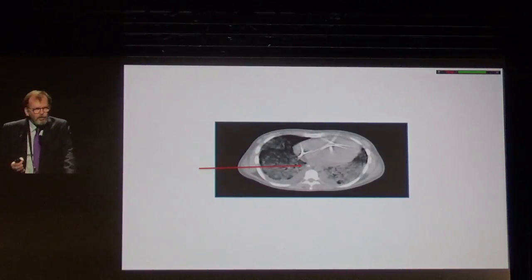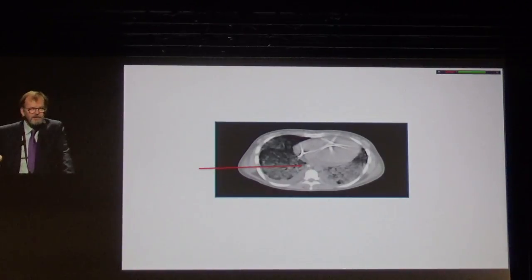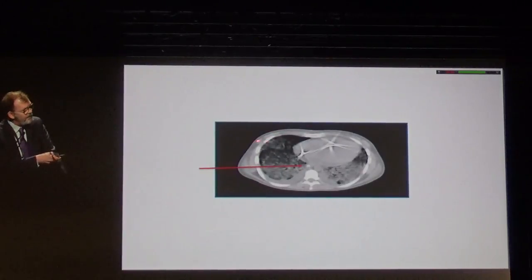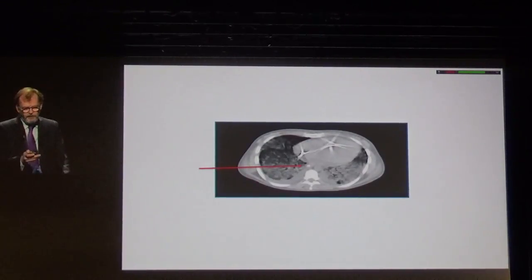And the very important point, which matters a lot for mechanical ventilation, is that the pleural pressure is not one pressure. There is a gradient, as described by Antonio, which goes from the non-dependent part of the lung, which is probably the part of the lung which is the more at risk of hyperinflation, right?